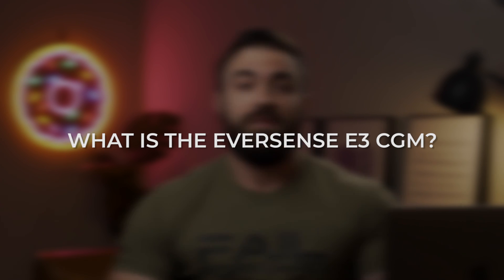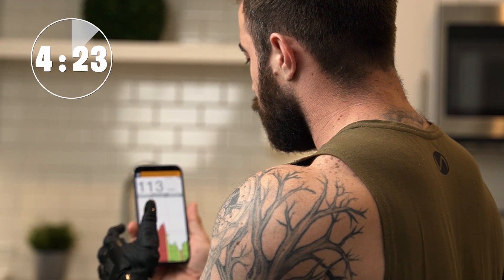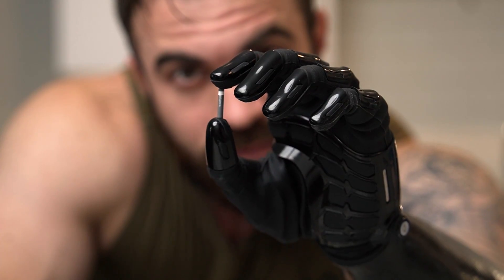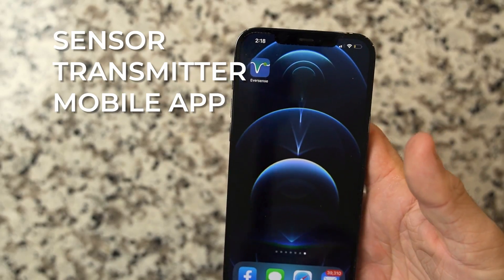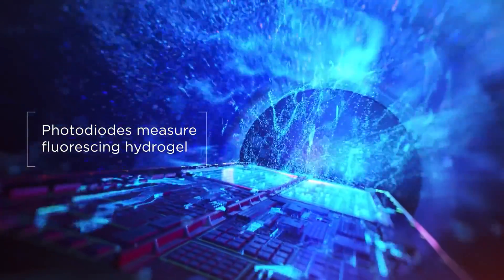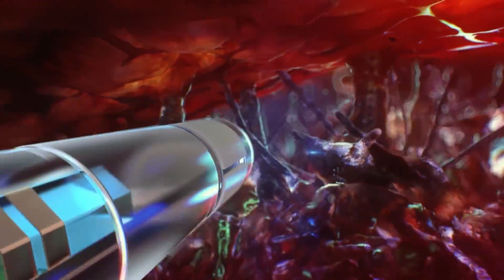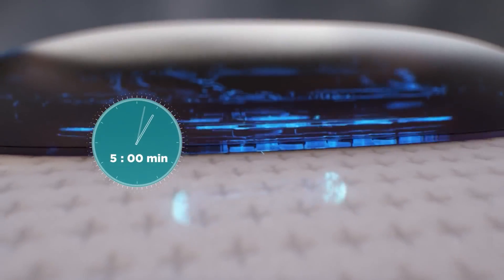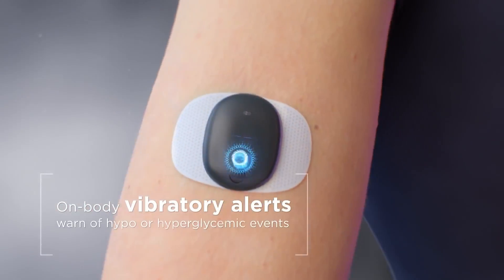So what is the Eversense E3 CGM? It's a continuous glucose monitoring system that gives you real-time blood sugar updates every five minutes. As a person with diabetes, it's extremely important to know not only where you are, but where your blood sugars are going. The system includes a fluorescence-based sensor implanted under the skin, a smart transmitter placed over the skin over the sensor, and a smart mobile app. The smart transmitter wirelessly powers the sensor, activating it to flash an LED light source. A fluorescent polymer coating on the outside of the sensor responds to the LED light — glucose from the body reversibly binds to the coating, and the amount of light emitted rises and falls with glucose concentration. Photo detectors inside the sensor measure this emitted light, special circuitry digitizes the measurements, and the smart transmitter calculates the glucose value, direction, and rate of change, sending that information to the mobile app.